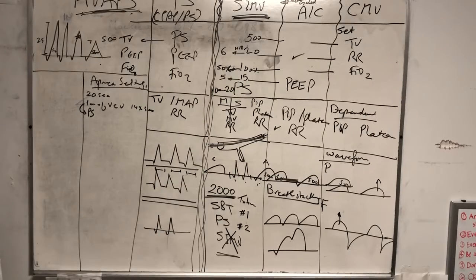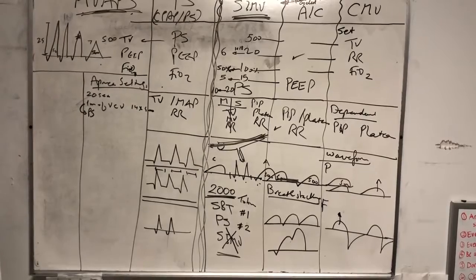Apnea is not a failure of the SBT, it's a failure of the respiratory therapist, or the nurse, or both, or us, or the doctors too, because you're not doing wean sedation or whatever. So if somebody is apneic on SBT, number one, that's a great indication for me that this patient is going to be extubated. You know why? Because he doesn't want to breathe fast. He's not tachypneic. He's relaxed, too relaxed actually, right? That's number one.